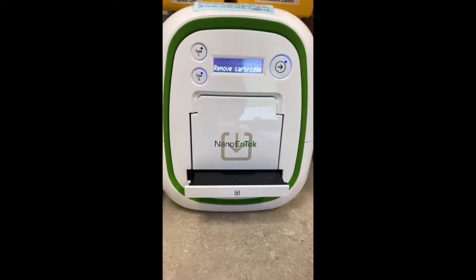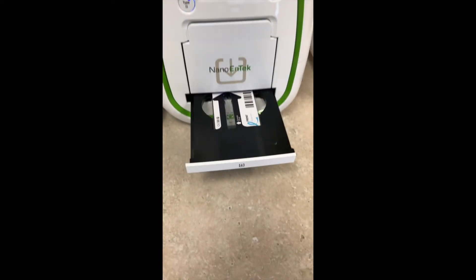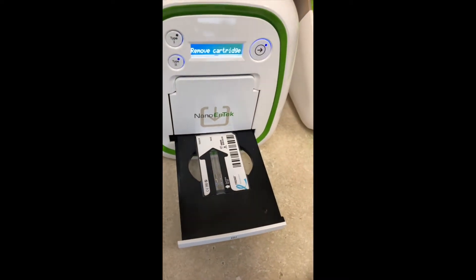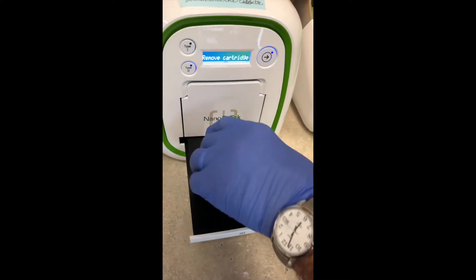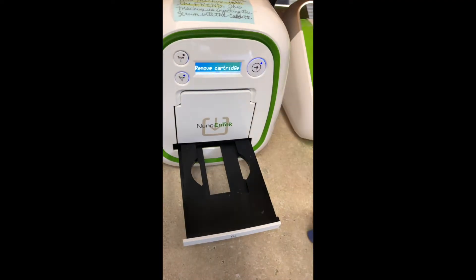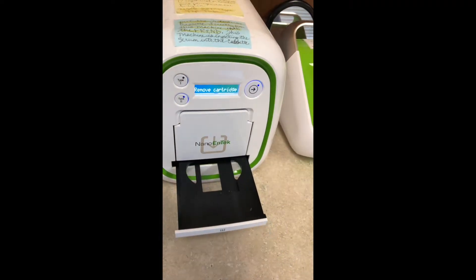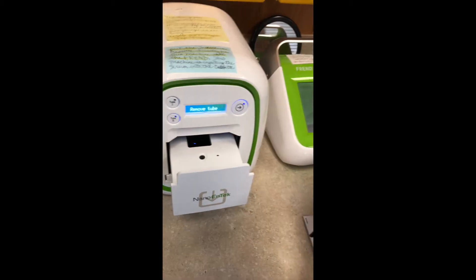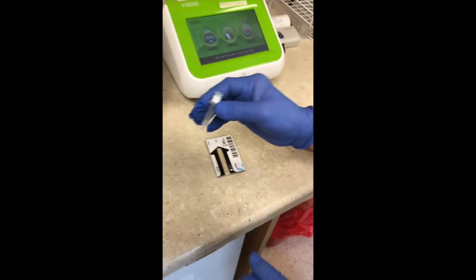It's finishing the incubation phase. It's going to beep — it won't stop beeping until you come in and do something about it. So you take the cassette out, push the button, take the tube out, and throw the tube into the biohazard waste.